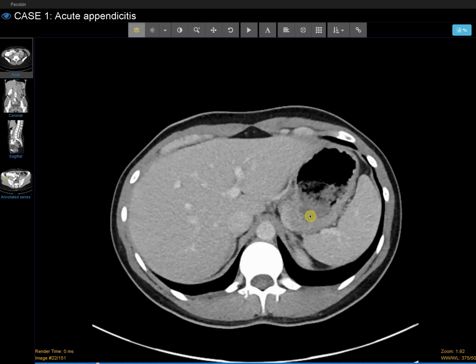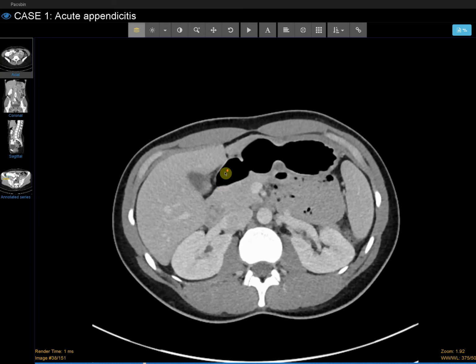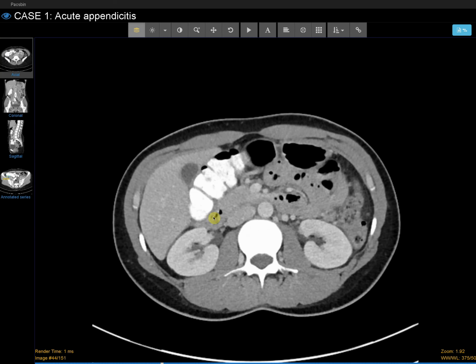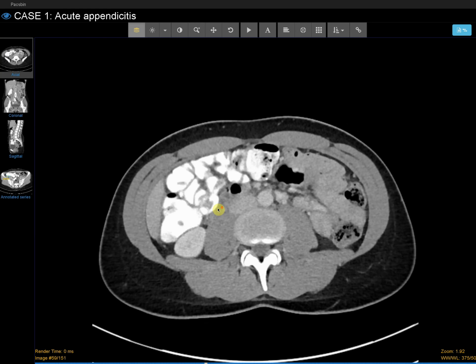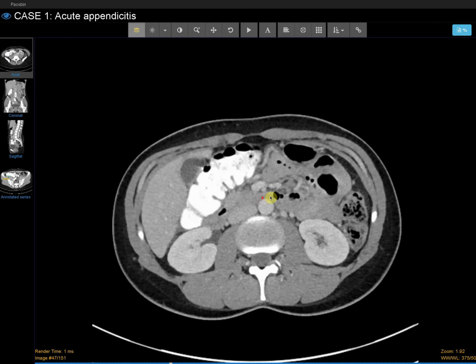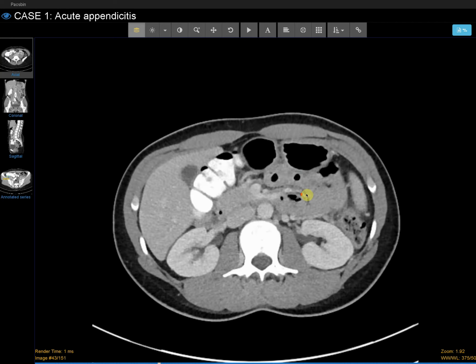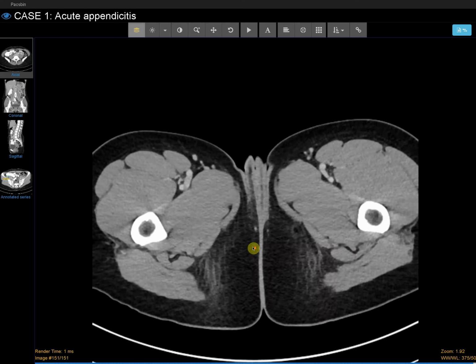There's my stomach. There's some food in the stomach. And probably here is where my duodenum starts. And then let's go down, and then I want to see the duodenum pass in between the aorta and the superior mesenteric artery, and I think right here is where it passes. So even though it's kind of hard to see, we can kind of make out that the duodenum goes this way, our jejunum on this side, our ileum on this side. And yeah, that's the case.